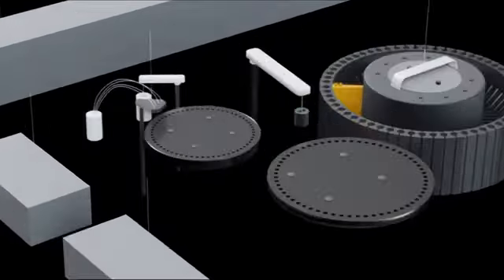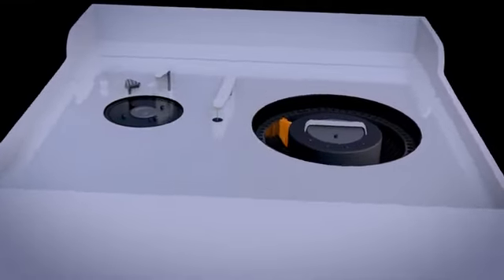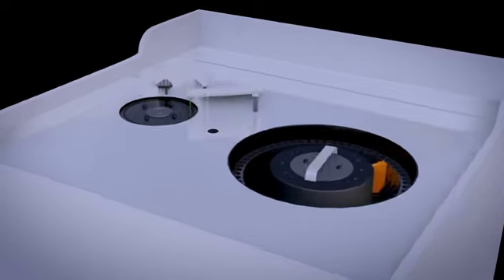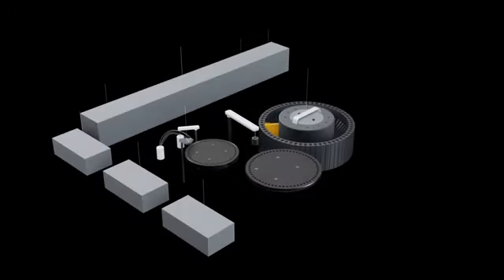This module holds the batch of samples awaiting analysis in separate cups on a circular tray which is rotated at intervals. A probe connected by plastic tubing to the proportionating pump enters each sample serially. The volume of sample aspirated is determined by the pumping rate and the adjustable dwell time of the probe in the sample. As the probe movement into the sample cup was slow, the volume aspirated varied somewhat with the depth to which this was filled. The transit time between reservoir and sample is short.